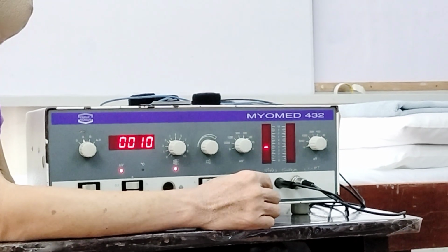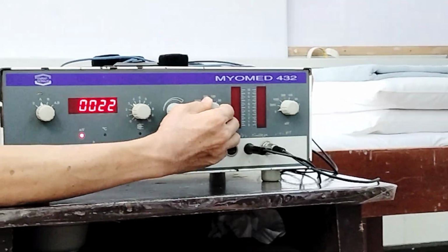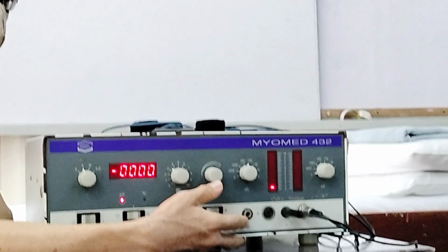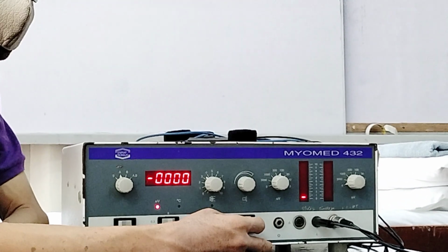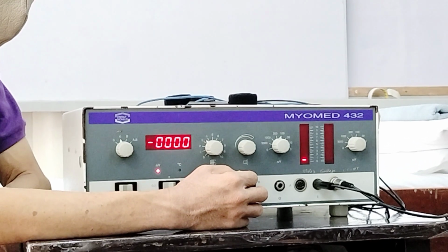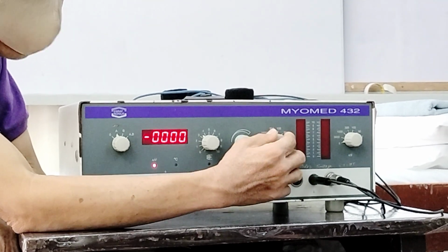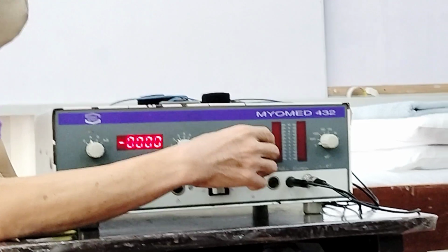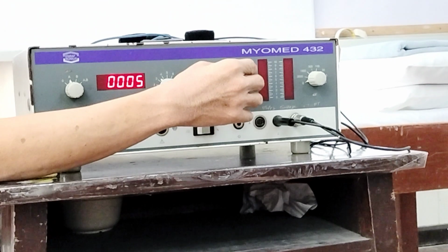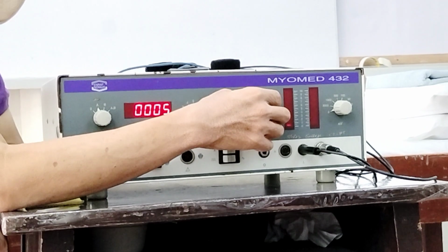Until such that you're going to further increase, until you're able to achieve your goal there. So, again, with regards to the level, it doesn't mean for a normal muscle na maka-reach siya up to 3,000 and maximum siya. It doesn't mean na yun ang aim mo, makaabot siya sa 3,000 or full. So, where are we going to base that we can really say na okay na siya, di na siya mag-undergo biofeedback training.